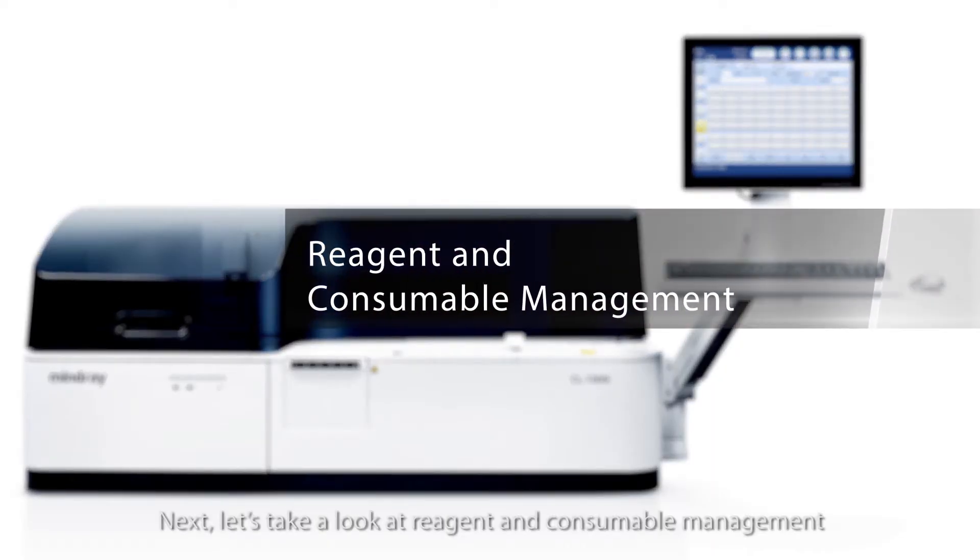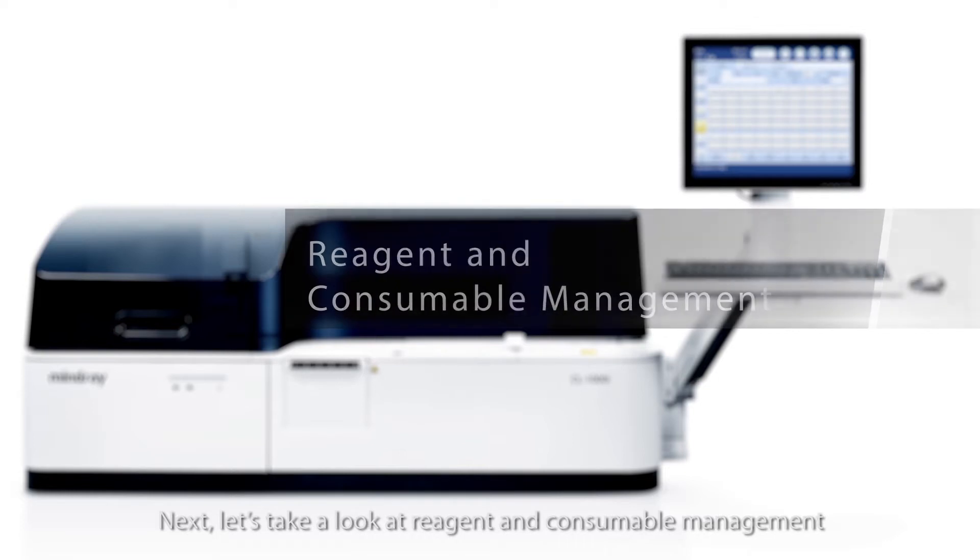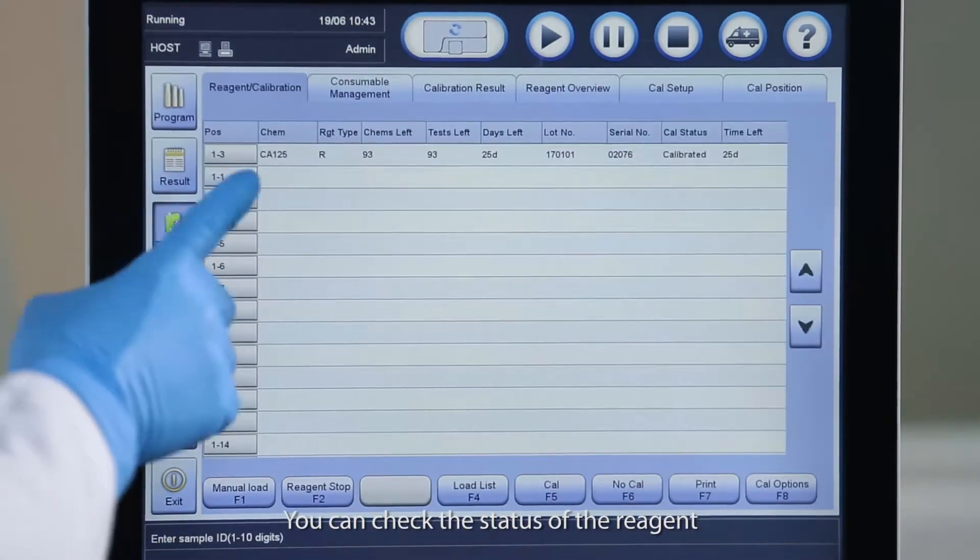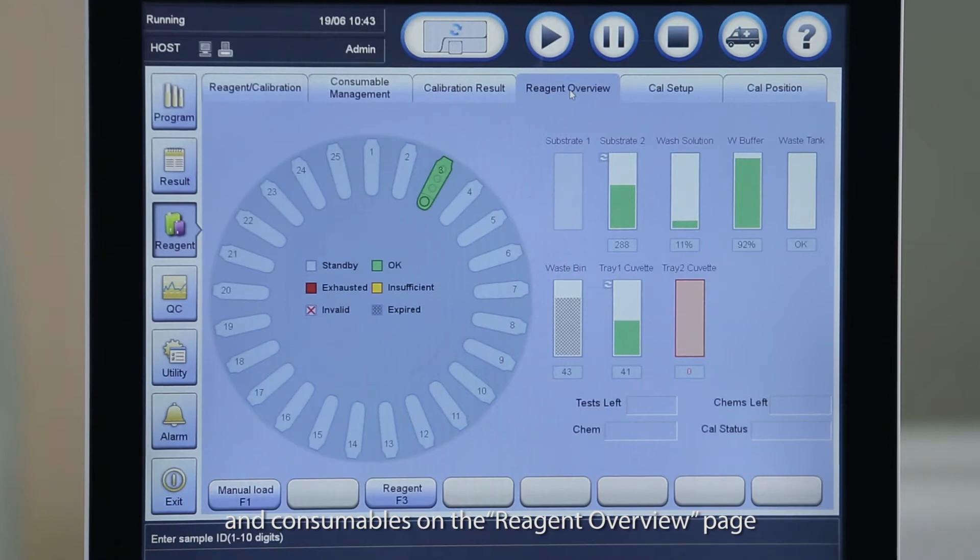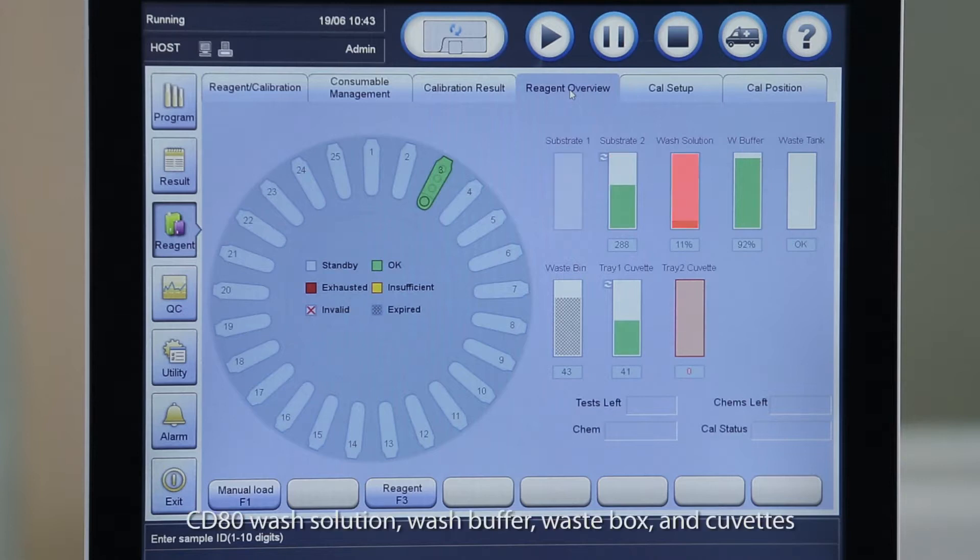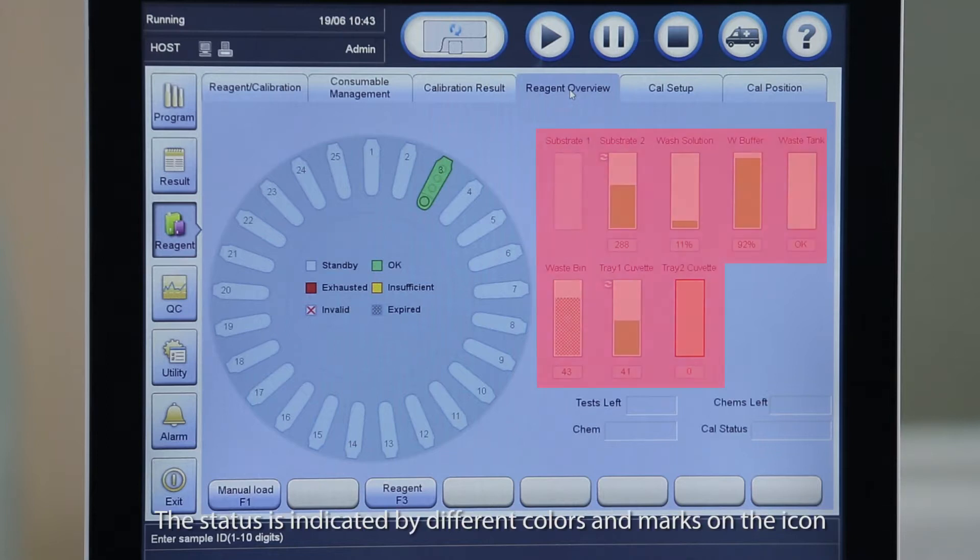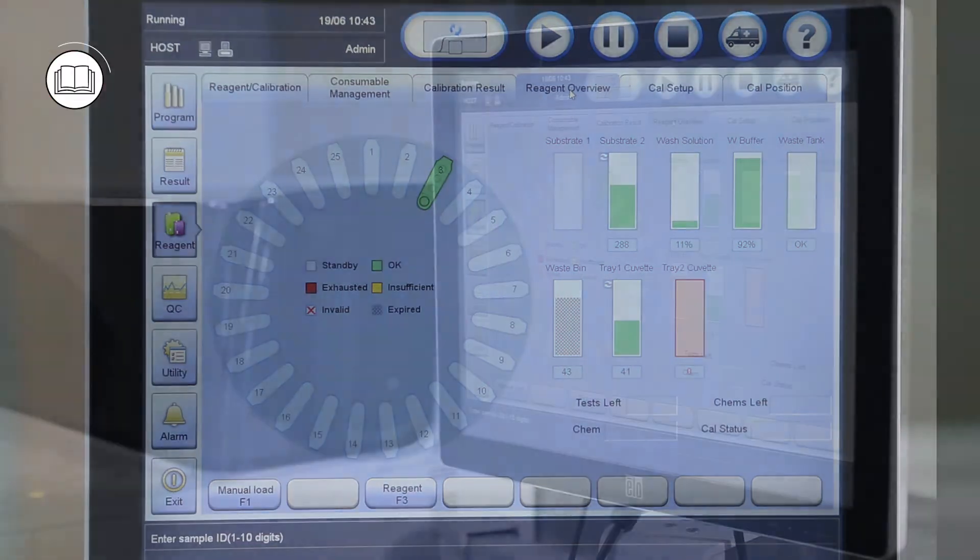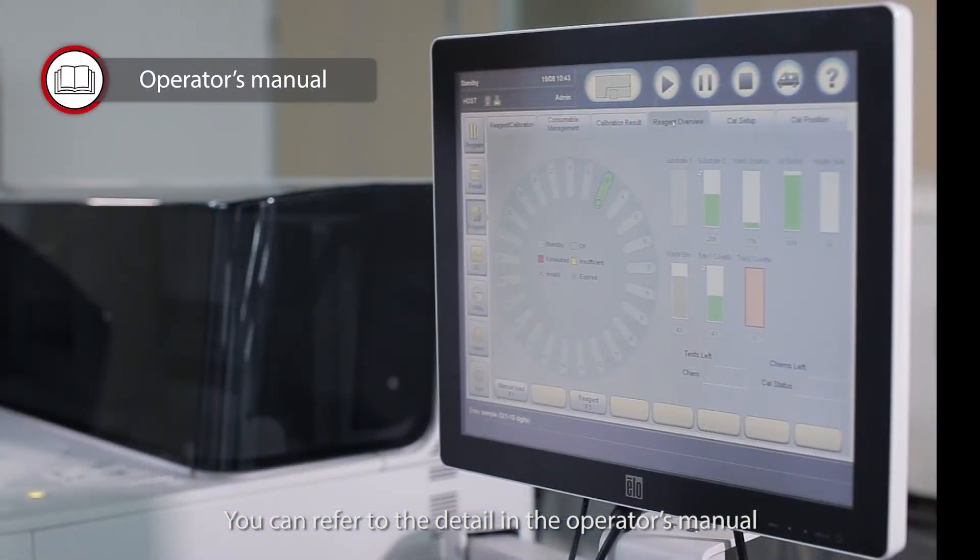Next, let's take a look at reagent and consumable management. You can check the status of the reagent and consumables on the reagent overview page. MindRay CL1000i and CL1200i use five kinds of consumables: substrate, CD80 wash solution, wash buffer, waste box and cuvettes. The status is indicated by different colors and marks on the icon. You can refer to the detail in the operator's manual.